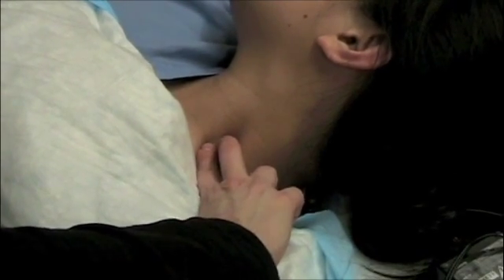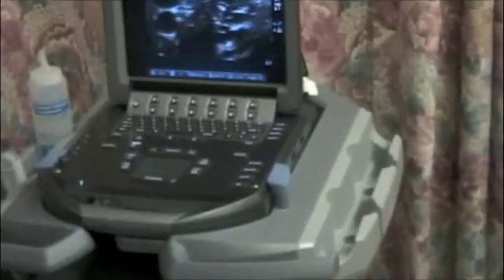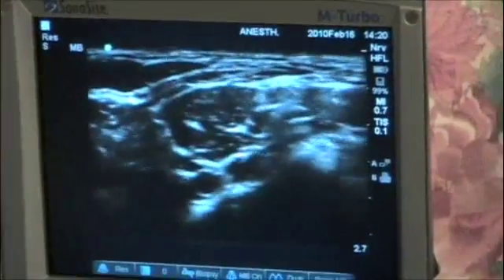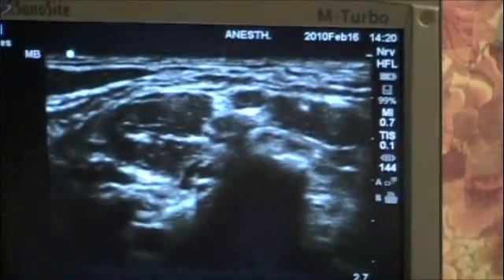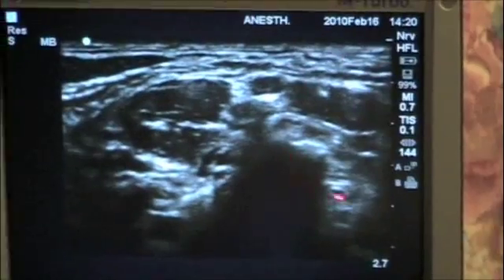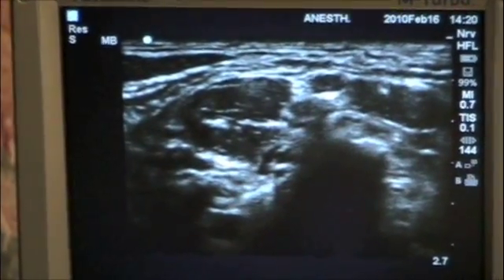Once we have identified that place, we place our ultrasound probe. On the left of the screen we can see the carotid, and as we slide a bit more lateral, we can see the brachial plexus. We can see the anterior scalene muscle, the middle scalene muscle, and the nerve roots — this is likely C5, C6, C7, and C8 and T1 are down here.